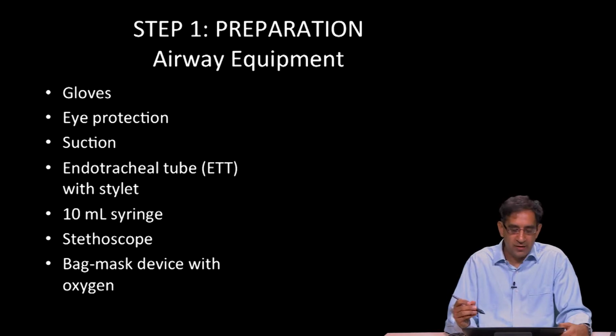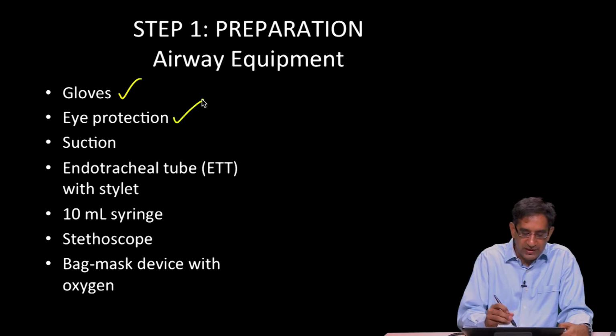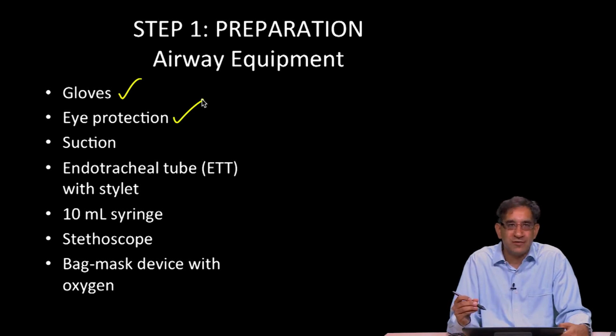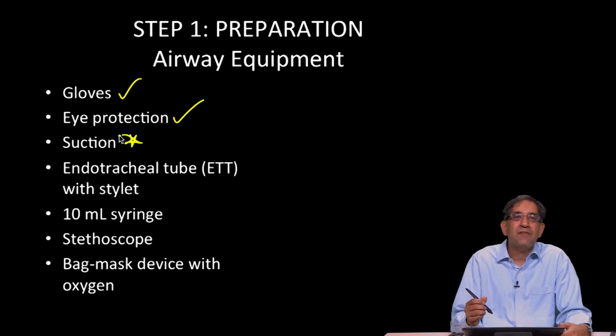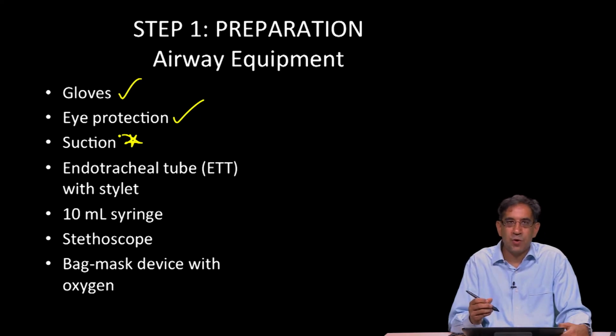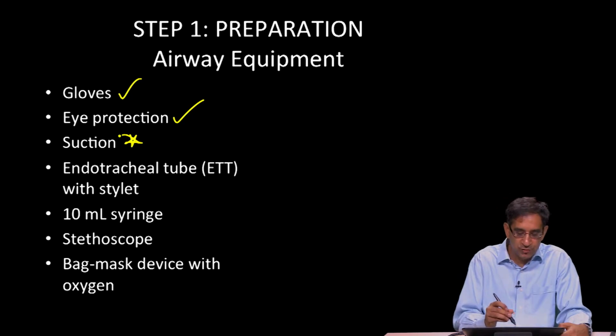So we're going to start with, obviously we talked about gloves and eye protection. This is personal protective equipment. You want to get your suction ready and have it on your right side, tucked underneath the mattress, and make sure that it's working, because you never know when the patient might have eaten or if there's going to be secretions in the airway. And so it can really help you visualize the vocal cords and remove any of those secretions to prevent aspiration.